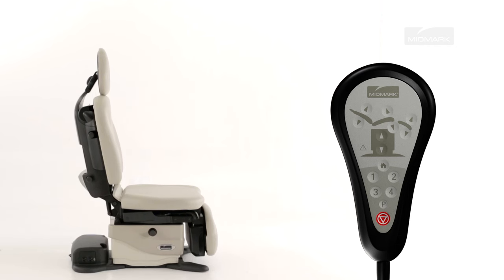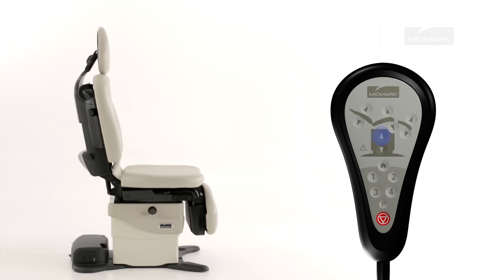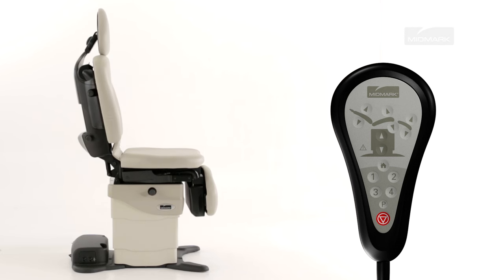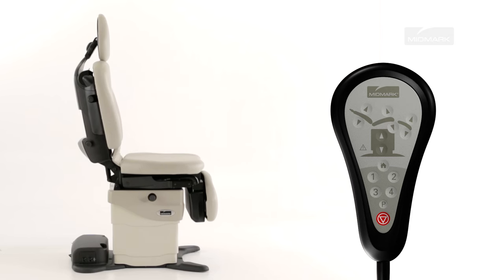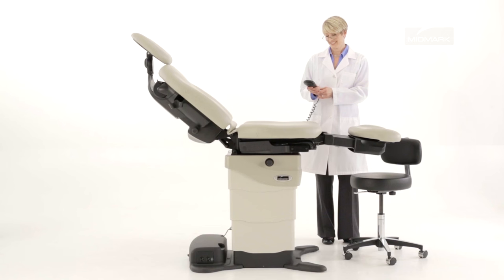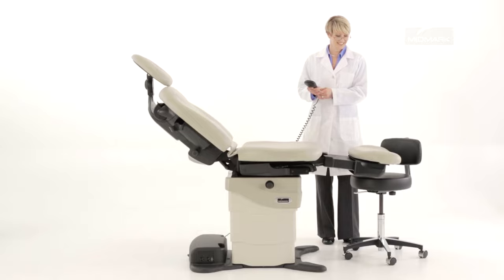To move the base up or down, press and hold the appropriate button on the table hand or foot control. Movement stops when the up or down button is released, the maximum or minimum position is reached, the active sensing technology is activated, or the stop button is pressed. The active sensing technology will disable the base down function if the foot section contacts an object other than the table.